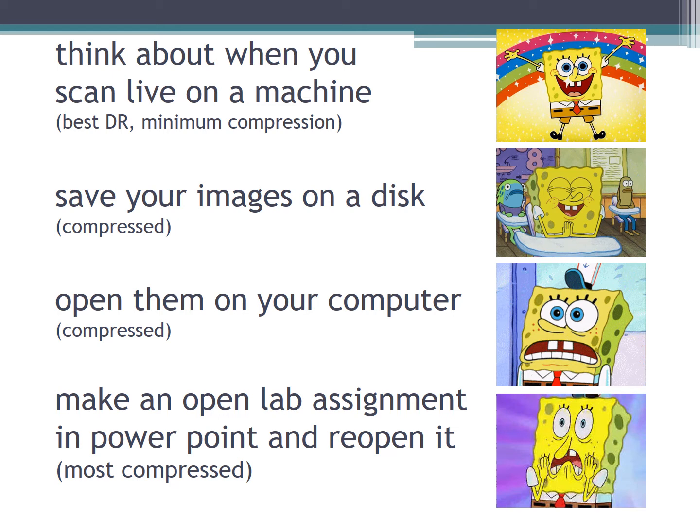So our absolute purest, cleanest picture would be if we could go and look right at what the transducer is seeing. That doesn't happen though. So as all that information moves through the machine, compression occurs so we can keep accurate information, but stay within the dynamic range of each component.